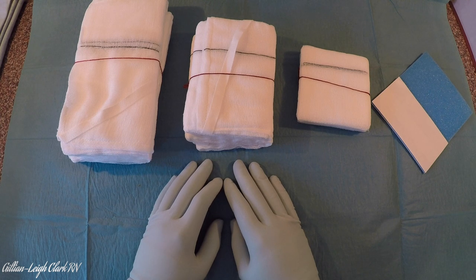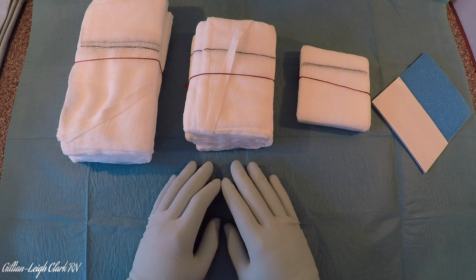Swab counting is an important part of surgery. We must count all the swabs at each closure and before and at the end of a case, so we know what goes in must come out. There are many things to factor in: what size of swab, how they'll be marked, how you'll be documenting them, and when they are used.